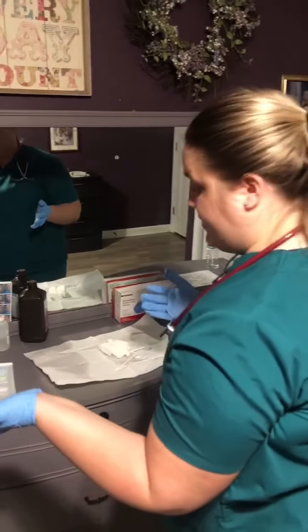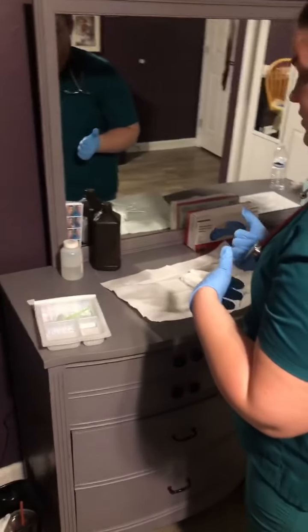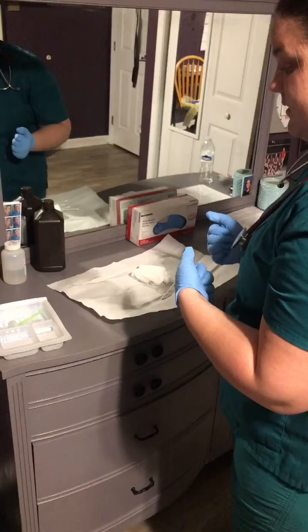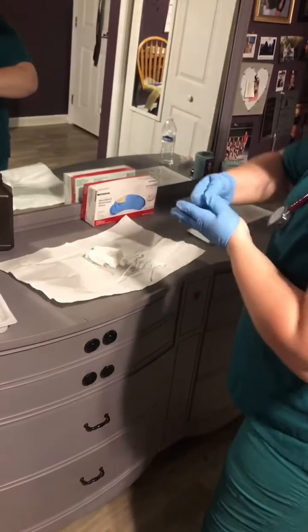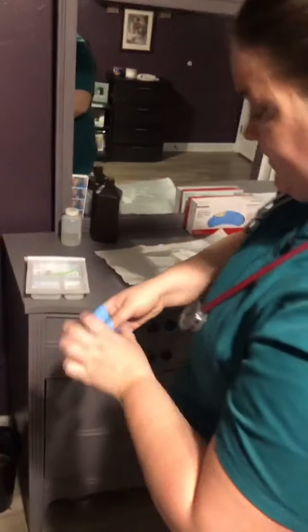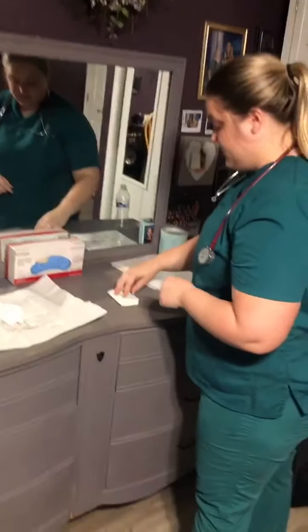So my patient has their oxygen back on. So now I'm going to clean the trach, the inner cannula. So I'm going to take off my clean gloves, throw them in the trash, and then I would hand gel and re-sanitize my hands. So now I'm going to get on my sterile gloves.